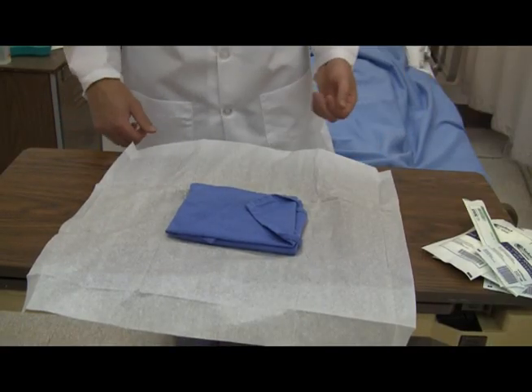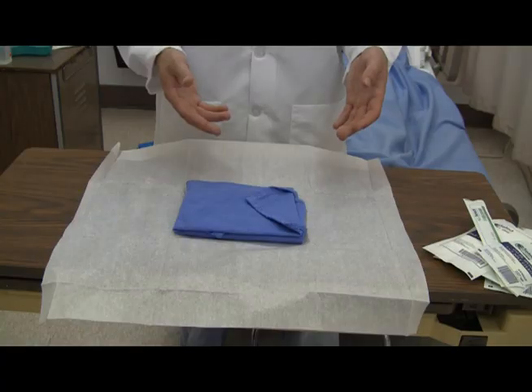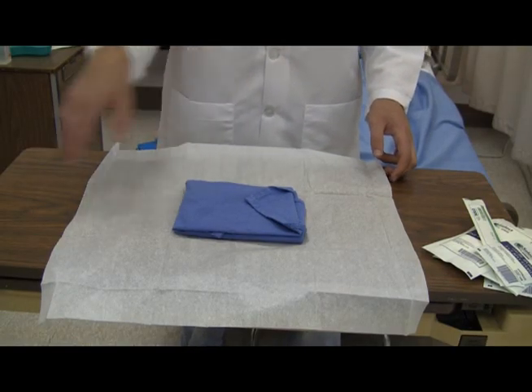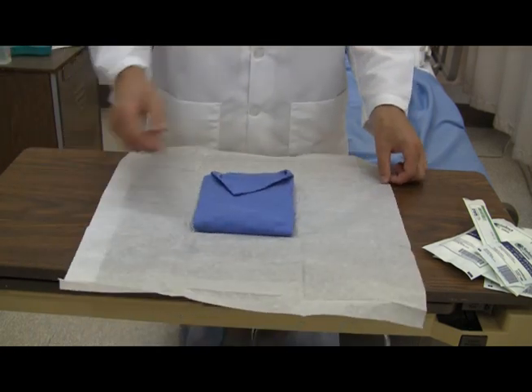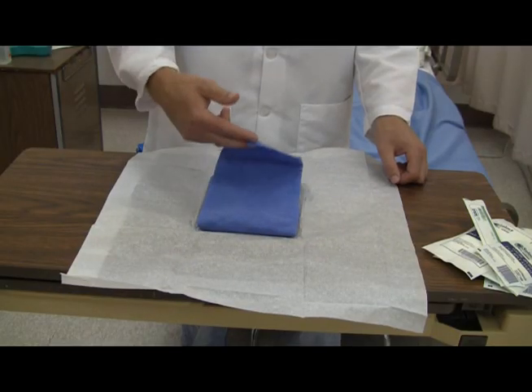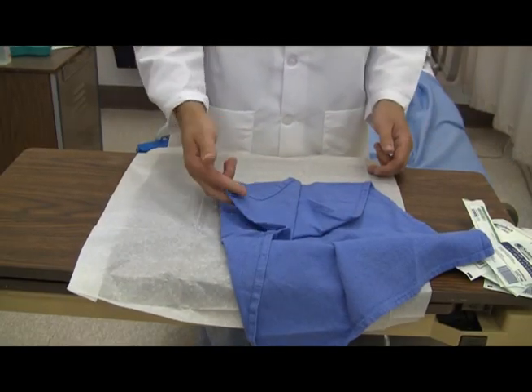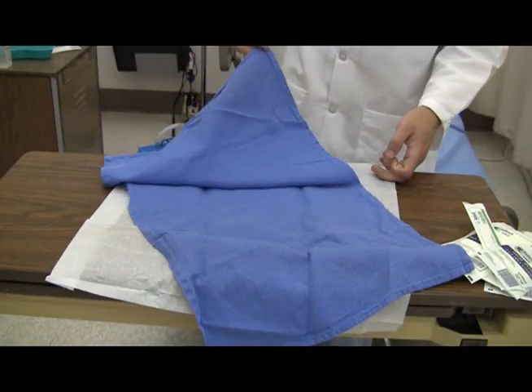So now we've opened the paper, we're going to open the towel. The most important thing right now is to open the towel away from yourself. In order to do that, look at this point. Right now it's pointing that way. It's going to open to the right. So I'm going to spin it. Now it's facing away from myself. I'm going to take my one hand, two fingers, and lift away. Two fingers underneath the cuff, to the left, to the right, and finally towards myself.